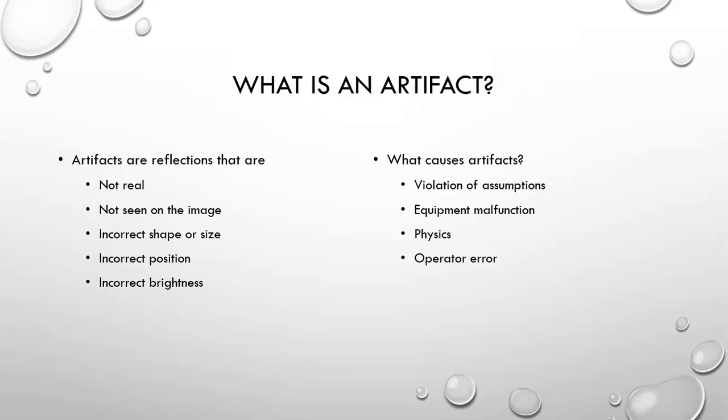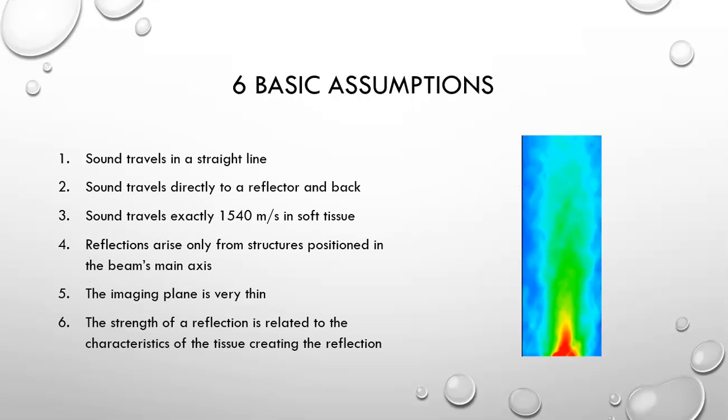All other causes of artifacts can be simply the equipment malfunctioning. There are physical principles such as refraction that we've already discussed that can cause artifacts. And the most common is often operator error. So let's look at our basic assumptions of the machine.